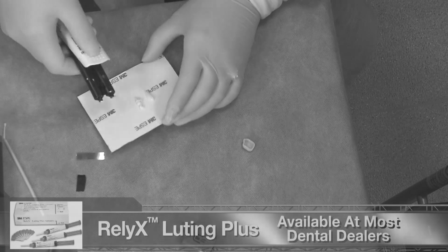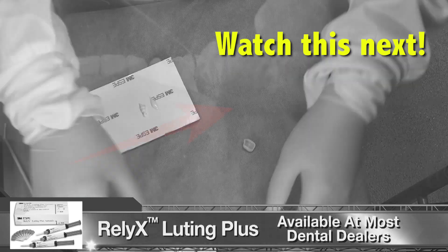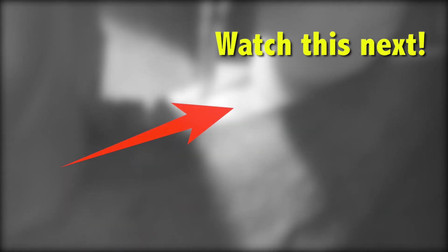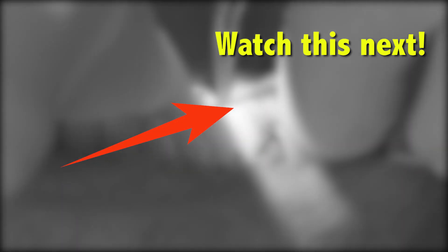We cement this crown in place using 3M's resin-modified glass ionomer, Relyx Luting Plus. The excess is easily removed when it enters a gel state after 2 minutes.